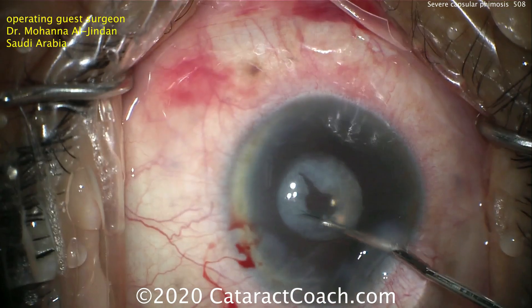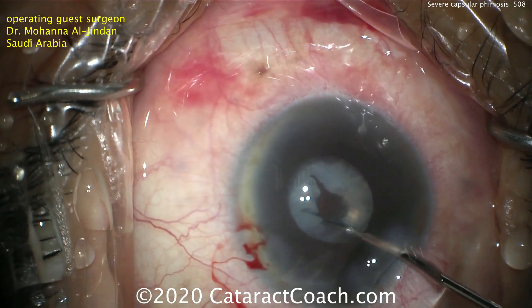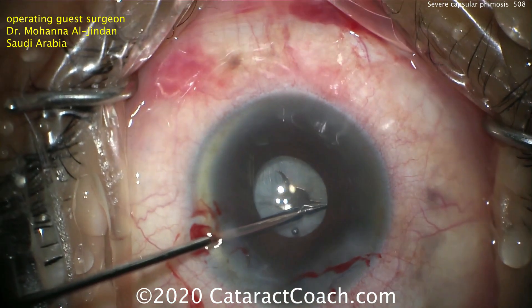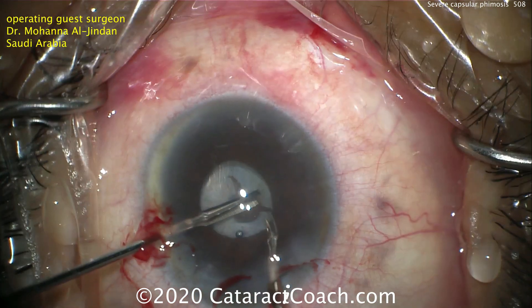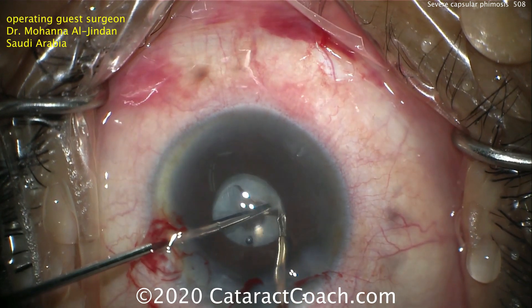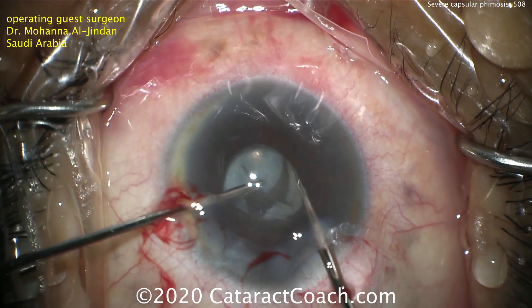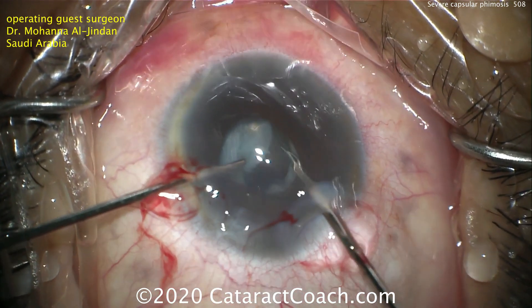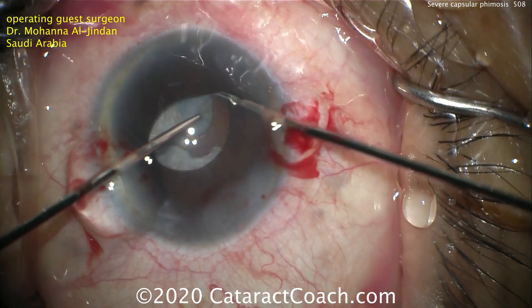So what's going to be the next approach? Using the micro scissors again. Dr. Al-Jindan is doing a great job of making more radial cuts to expand towards the periphery. Now those same scissors are going to be used to cut this tissue very carefully. You can see one hand — the left hand is using forceps to hold it, the right hand has the micro scissors — and the tissue is very carefully cut.